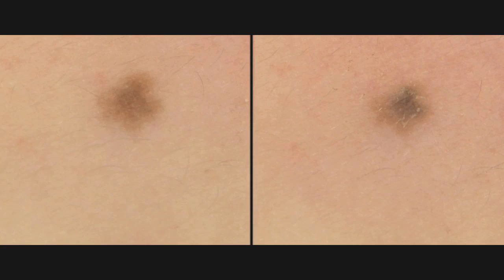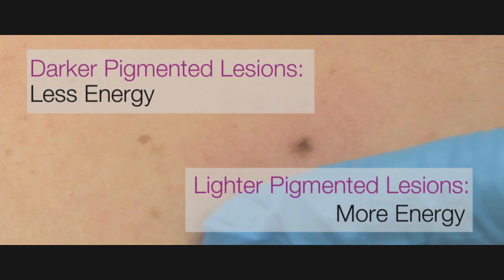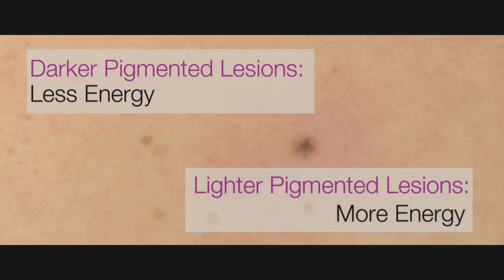This is the ideal treatment response. It is also acceptable to see only a darkening of the lesion. The response will depend upon the amount of pigment in the lesion. For dense and deeply pigmented lesions, less energy will be required and the response will be more robust. For lighter lesions, more energy may be required.